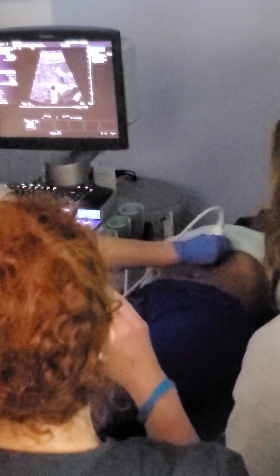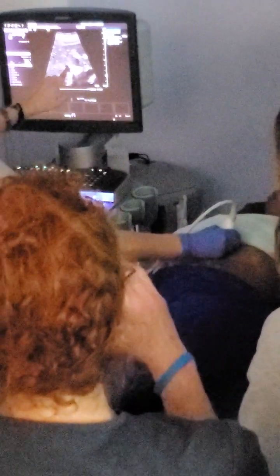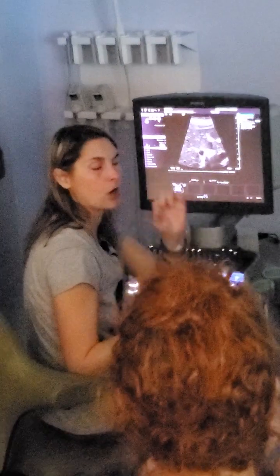So there's my first image. There's the neck. And one thing you can do to check if you're oblique or not is you should have the same thickness throughout the entire gallbladder wall. You shouldn't have the anterior looking one way and the posterior looking thick, or the whole thing looking thick. It should be a little bit more symmetrical around the whole thing.